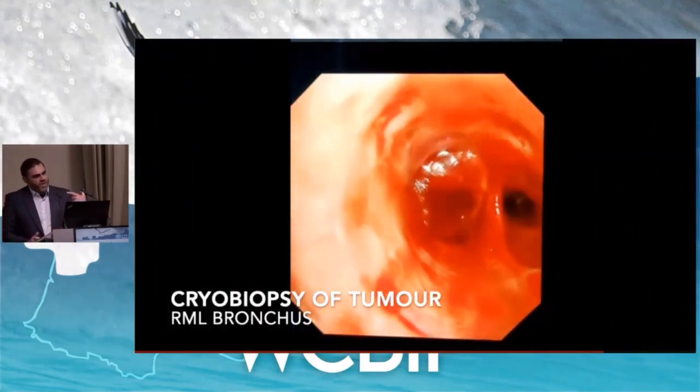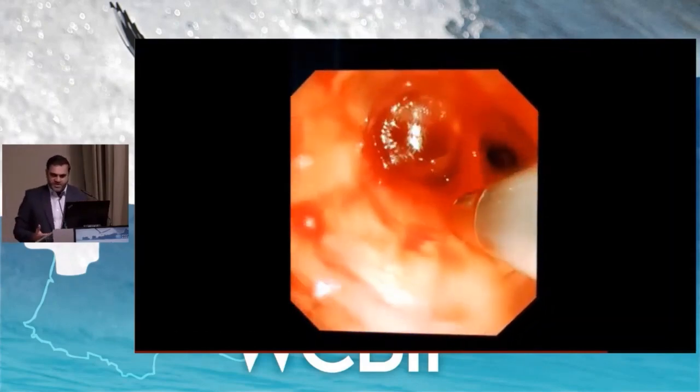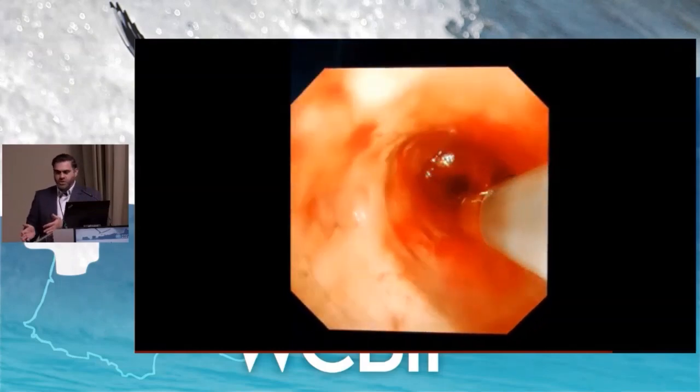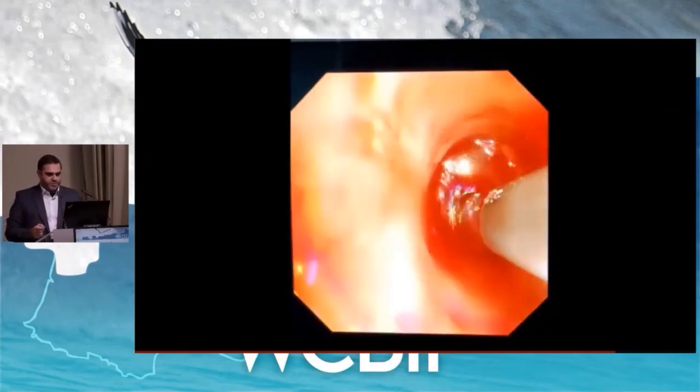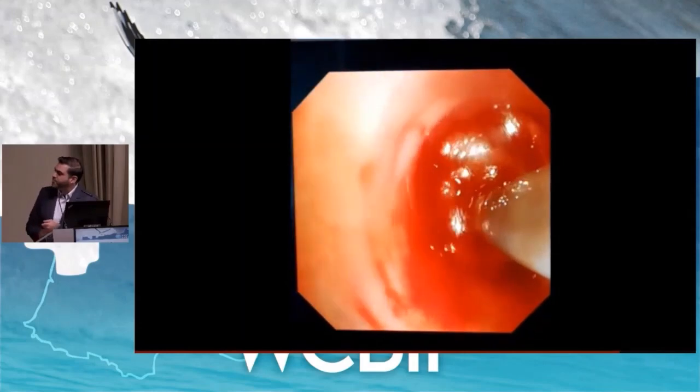Okay. So this is very much an unedited video, and what we would really see. I wanted to keep it unedited because I want to show you how things look when we look down the bronchoscope and when we do these sort of procedures. So I proceeded, for this patient, to take a cryobiopsy from his tumor.